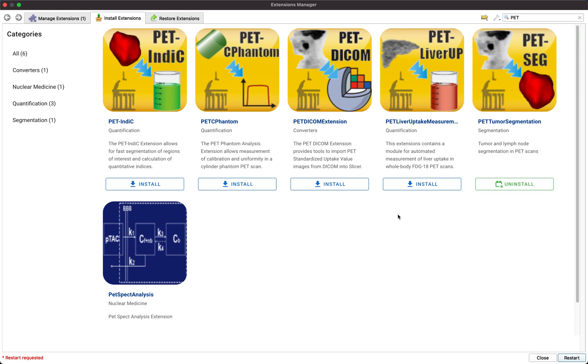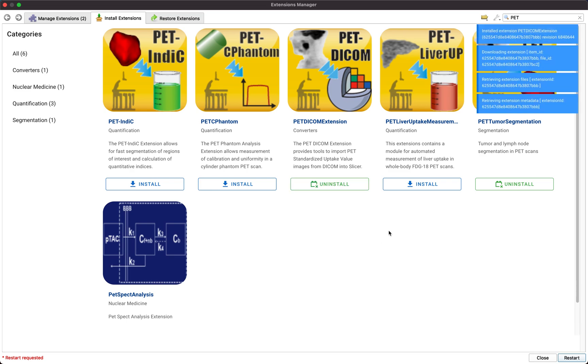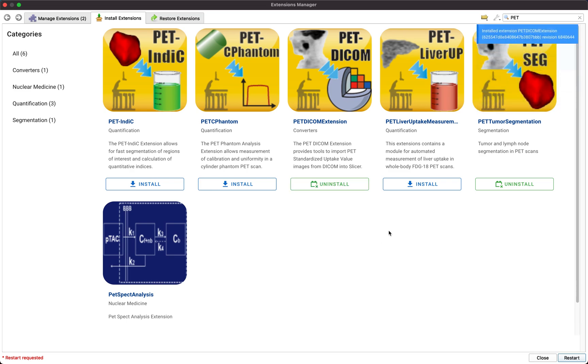In this video, we will use it in conjunction with the PET DICOM extensions, which allow loading PET DICOM datasets as SUV normalized images. After installation, restart 3D Slicer.